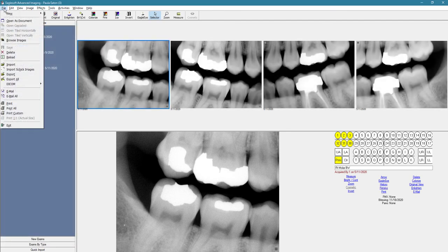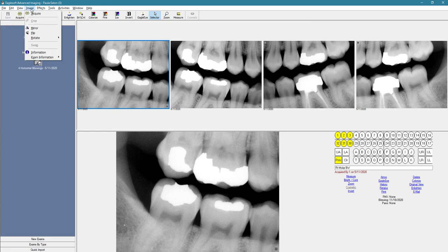Here on the top menu, under file, is where you're going to be able to import and export images. Under image, you're able to mirror, flip, or rotate the image in case it came in incorrectly.